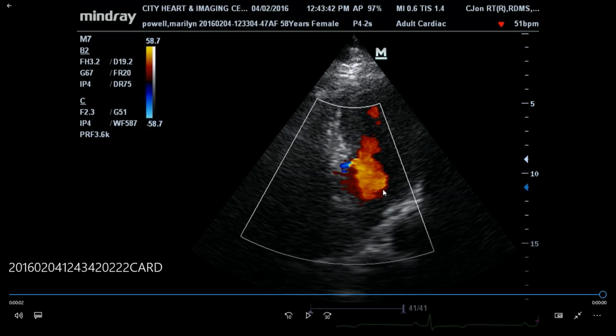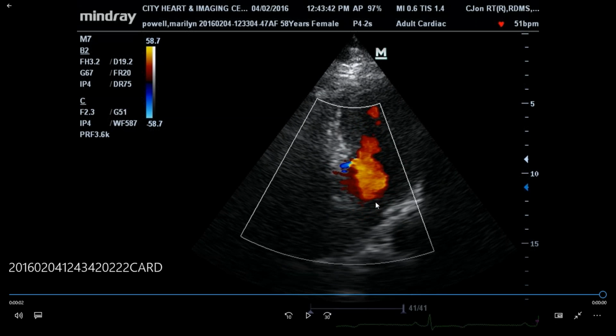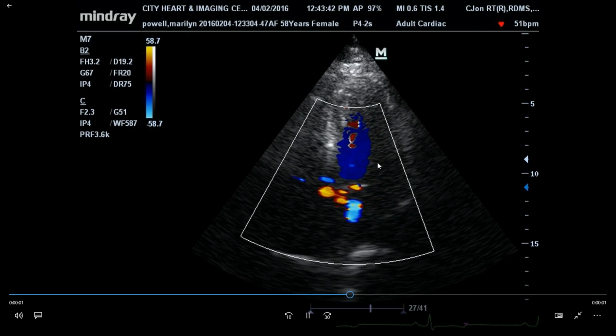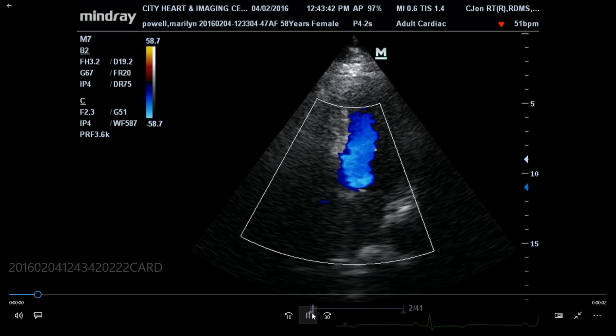It's across the mitral valve, so we have flow from the left ventricle across the mitral valve into the left atrium. That's the definition of mitral regurgitation. That's what mitral regurgitation looks like right there. And this red is just normal flow in diastole, where blood flows from the left atrium across the mitral valve into the left ventricle. That's a normal flow.